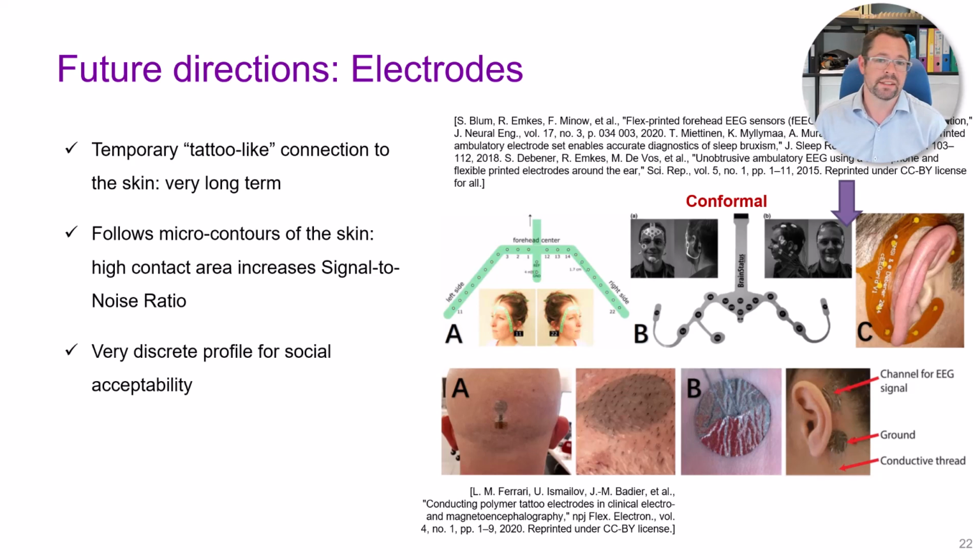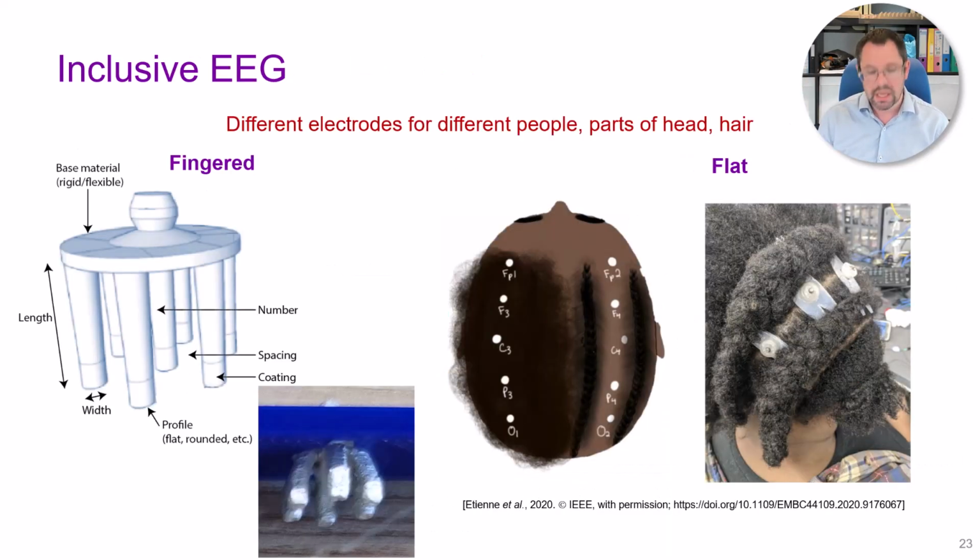You can see how that could let us monitor things like chronic pain in a way that we've not been able to do previously. Of course, most electrodes for many studies want to be placed on haired regions, and so there's work going into how we can make those better as well.